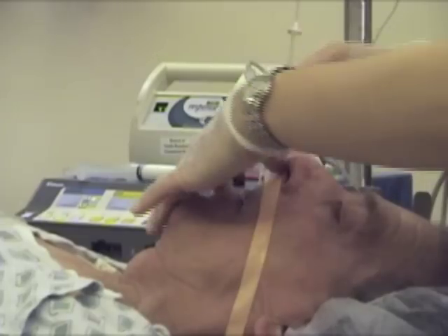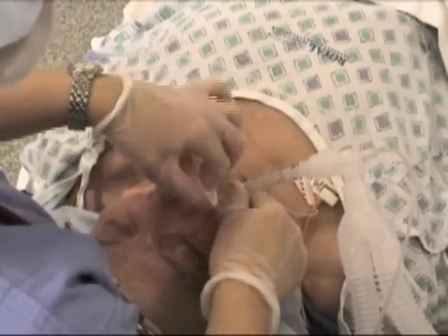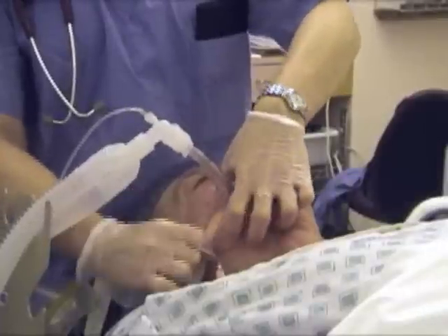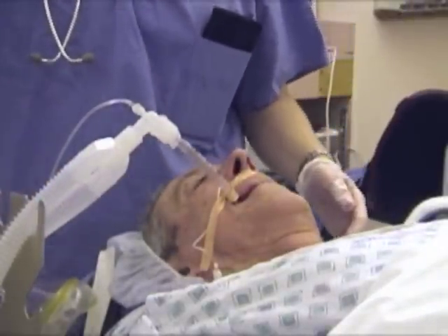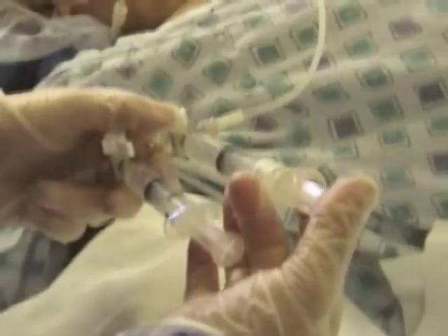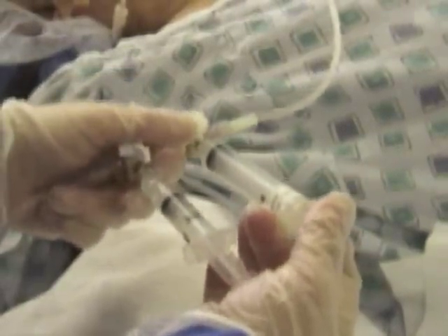First, attach the tape to the patient's cheek and then wrap it circumferentially around the tube. Next, affix the free end of the tape to the patient's other cheek. Pharmacologic sedation and hand restraints may be employed to prevent inadvertent extubation.